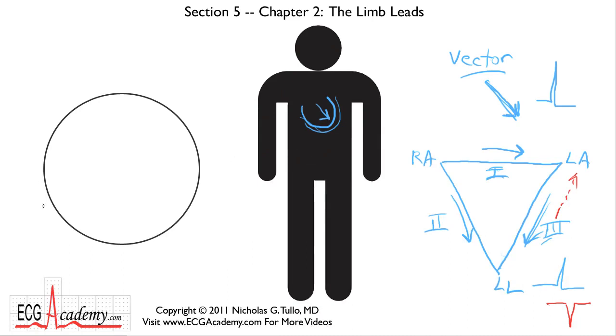The circle representing the frontal leads, which are the leads that we see in the front of the patient when we're viewing the front of him. Okay, and this circle is divided into 360 degrees. By convention, we usually divide this into 4 quadrants. And we consider that this angle to be 0 degrees, and the degrees go upwards from here, and negative degrees are this way. This will make a lot more sense when we talk about axis.